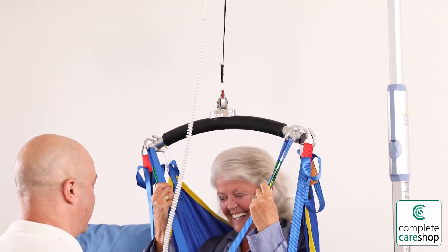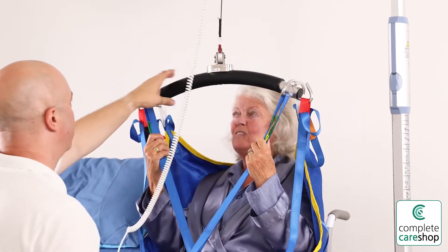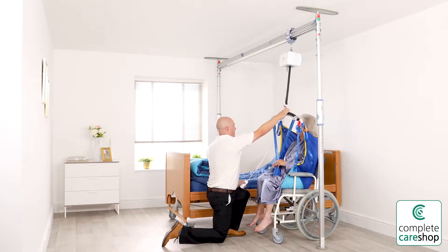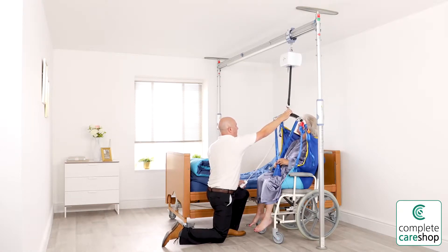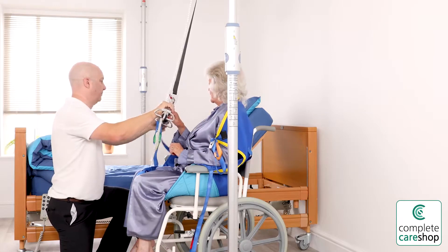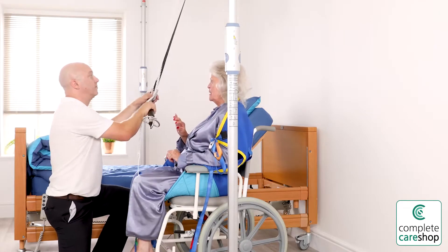The Prism Easy Fit consists of six main pieces: two adjustable uprights, a collapsible track section that can be extended to approximately 3 meters or 9.8 feet, two bottom plates, and two top plates. These combine to make a sturdy, semi-permanent structure that can be used without any structural alterations to the building.